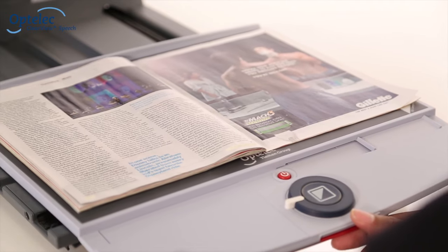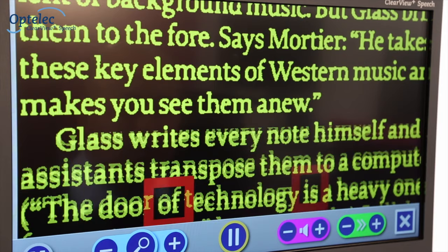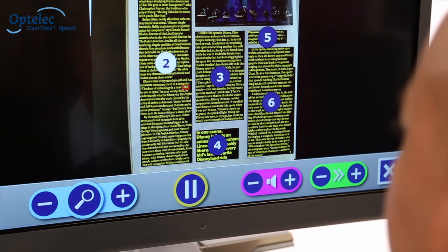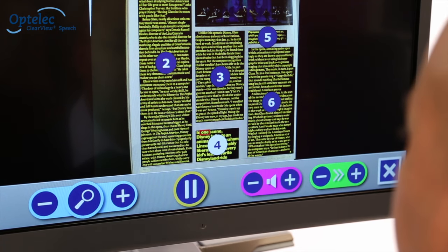Position a document into the reading frame and tap the screen again. The Clearview Plus Speech will automatically start reading aloud and will mark each paragraph. Select a paragraph on screen and the Clearview Plus Speech will read it aloud.